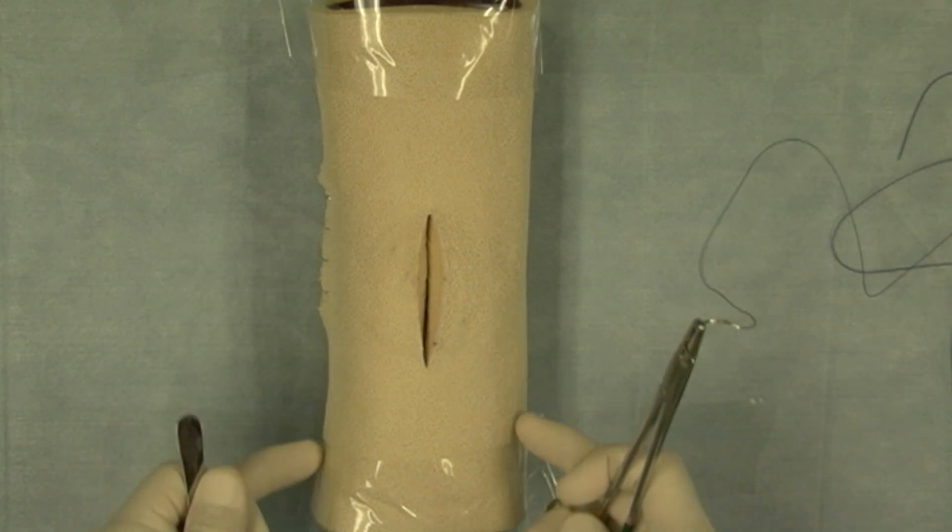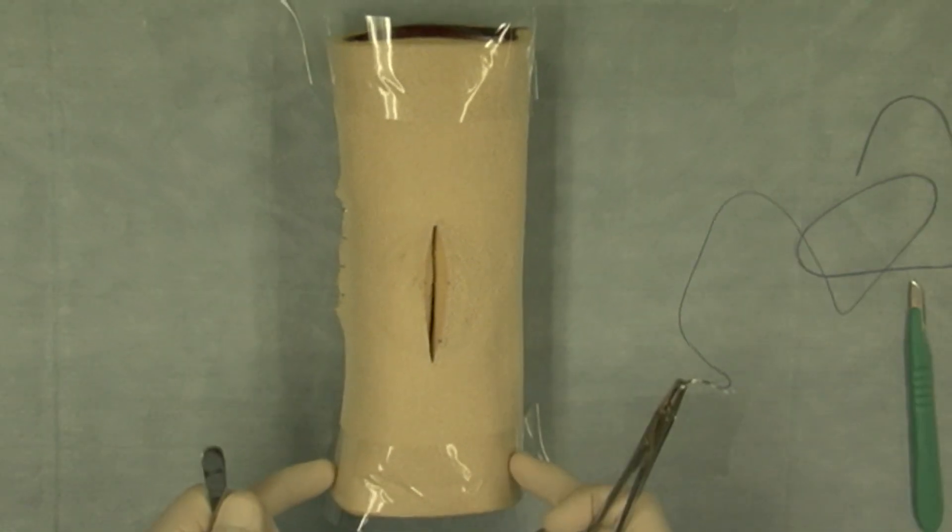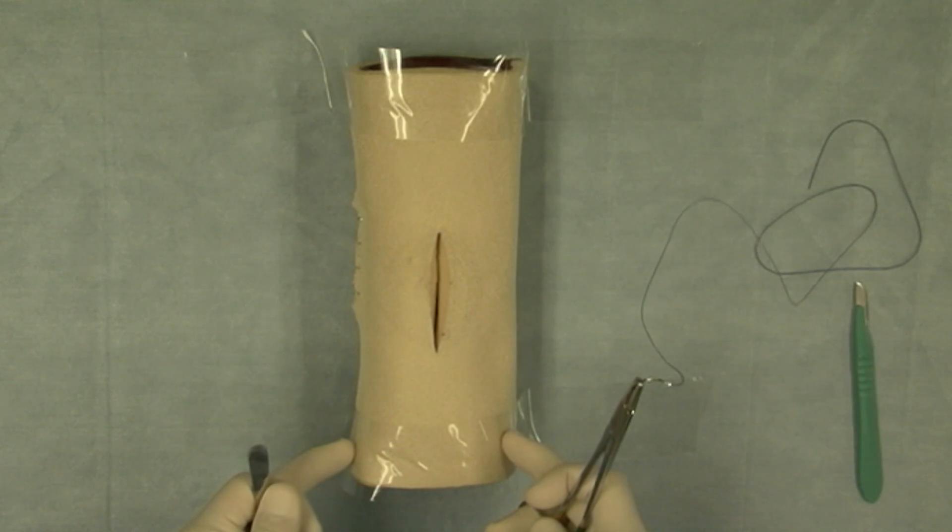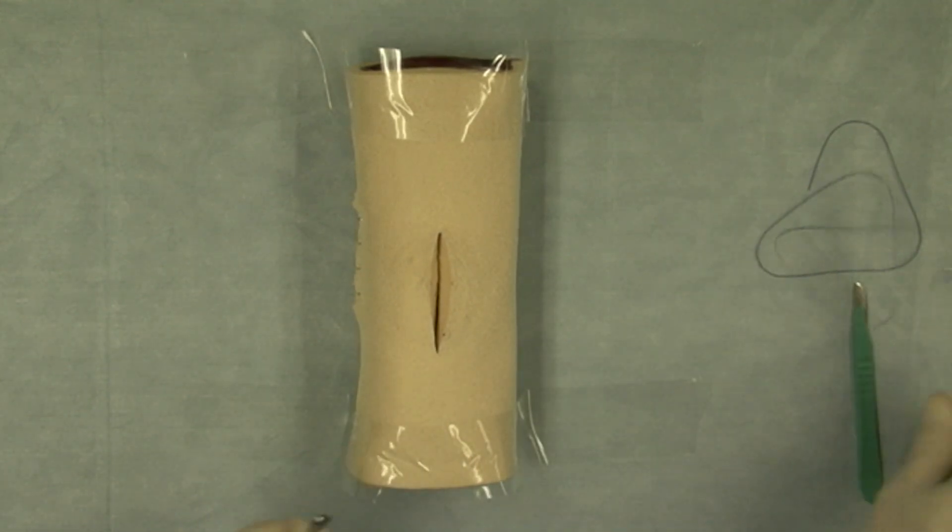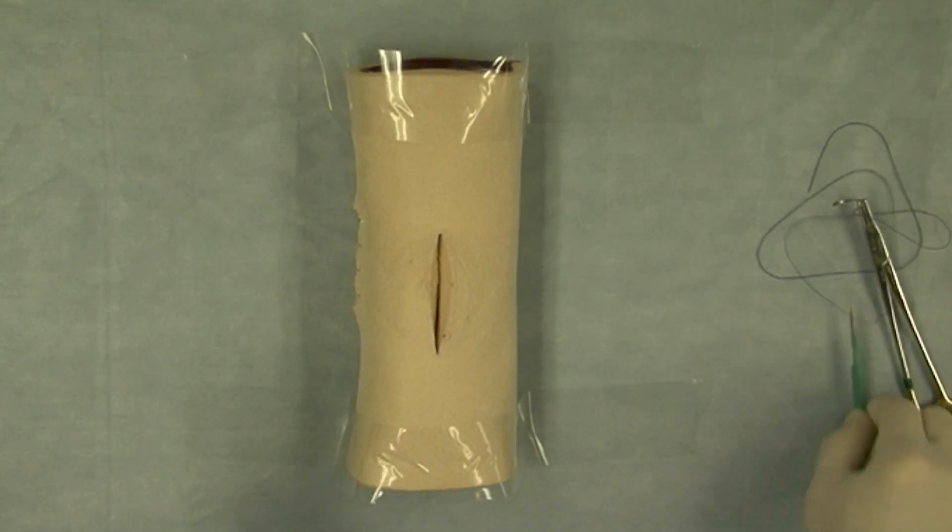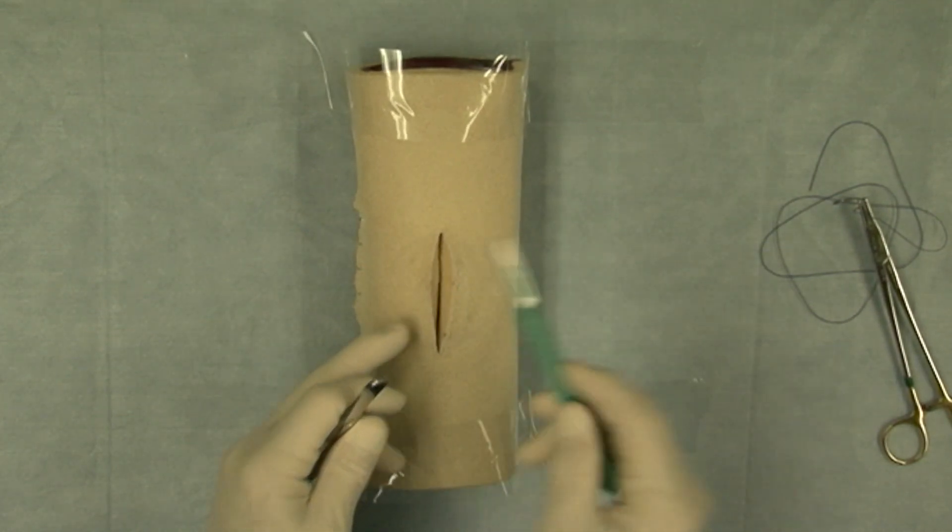Notice that I have the daisy positioned perpendicular to the table and I've already created an incision using a scalpel blade in the skin portion of the daisy.